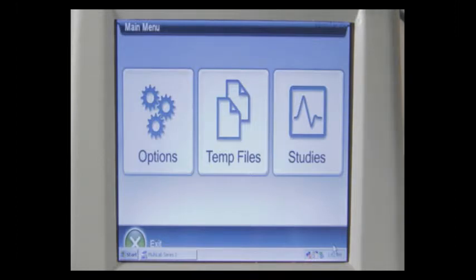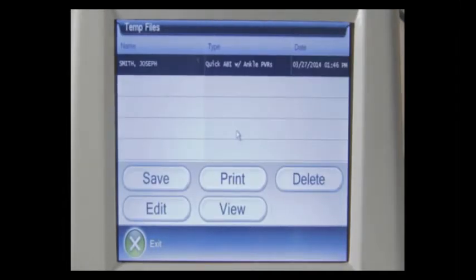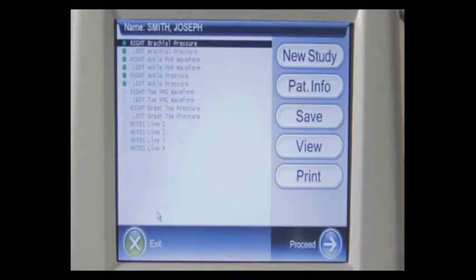The temp file button takes you to the temporary file screen. The REVO can hold up to five patients in memory before needing to delete them for newer patients. From this screen, you can see a patient and several options. Pressing the save button will save the patient study to a USB thumb drive in PDF format. Pressing the print button will print the patient report with the supplied color full-page printer. You can press the delete button to delete a patient after printing or saving, or press the edit button to go back into the study.